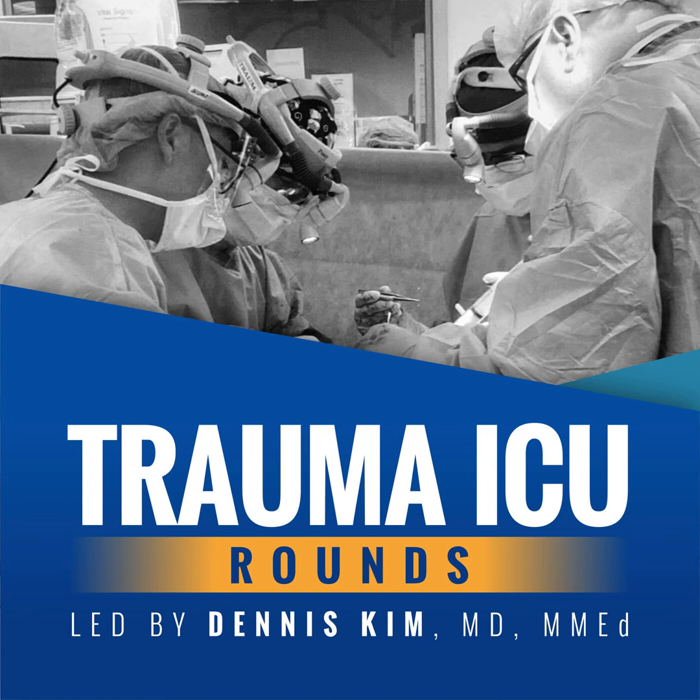In the trauma bay, we see a lot of patients who come in with an STBI, or severe traumatic brain injury. They're not able to protect their airway because their GCS is less than 8. And so those patients also will buy themselves an ET tube and ventilator.